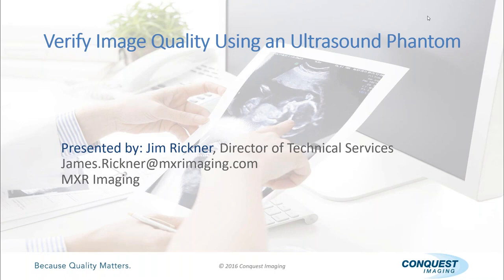So today we're going to be talking about image quality and how we can evaluate it using a phantom. And it's near and dear to my heart. I'll start it off by telling you a little story. I was a training director for Conquest Imaging before we became part of MXR. And I had all my engineers in for a weekend to get us all on the same page and talk about the same things. And one of the concerns was how we use a phantom.